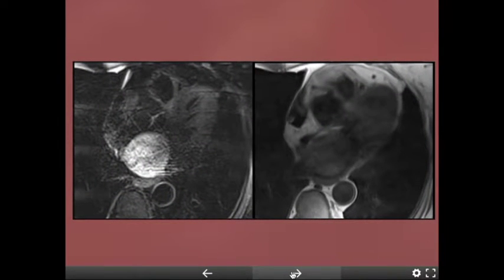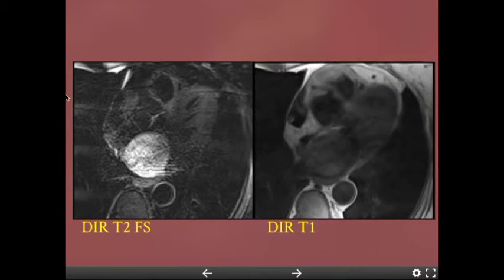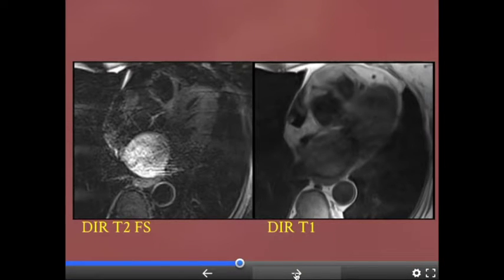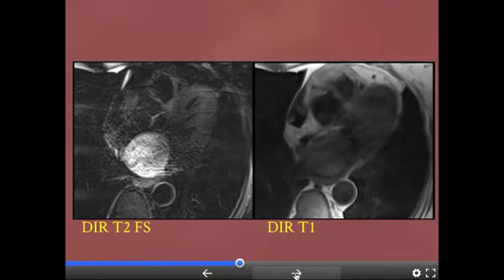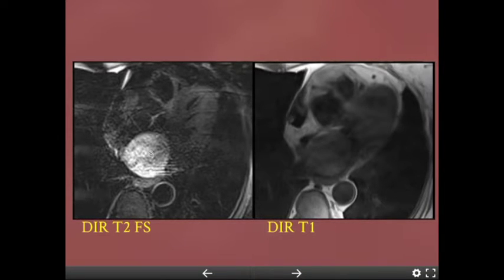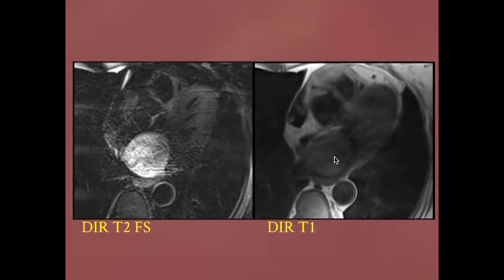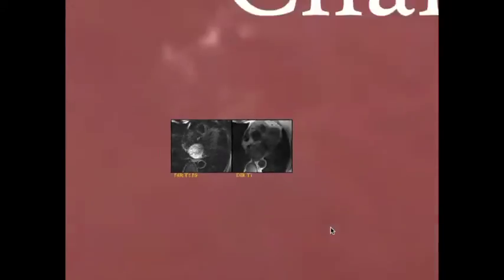Here's another mass: T1 and T2 sequences. This mass is bright on T2 — many masses are bright on T2. It's intermediate on T1. This is a huge left atrial mass — when thinking about left atrial masses, think myxoma. This is a big myxoma.